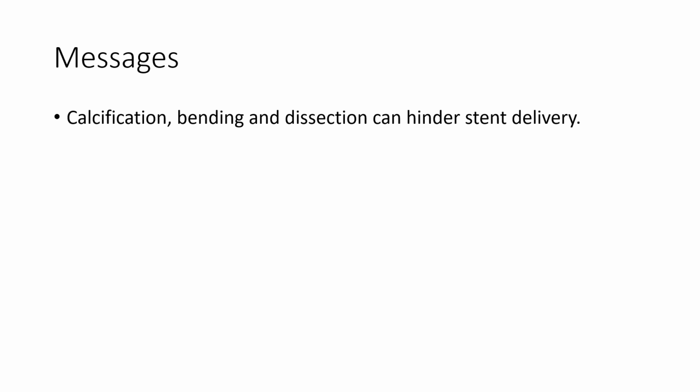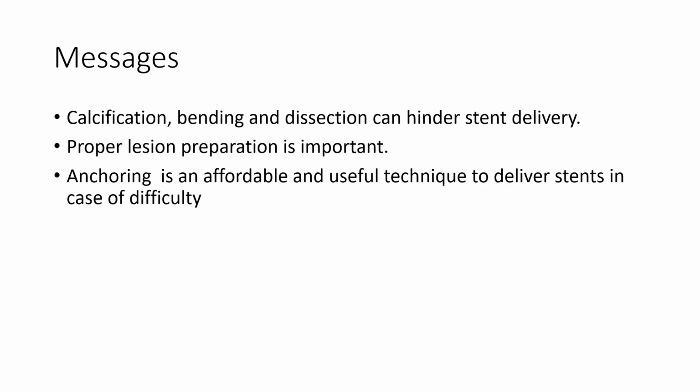So the messages are: calcification, bending, and dissection can hinder stent delivery. Proper lesion preparation is important. Anchoring is an affordable and useful technique to deliver stent in case of difficulty.